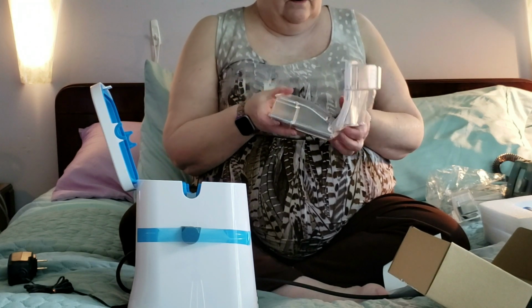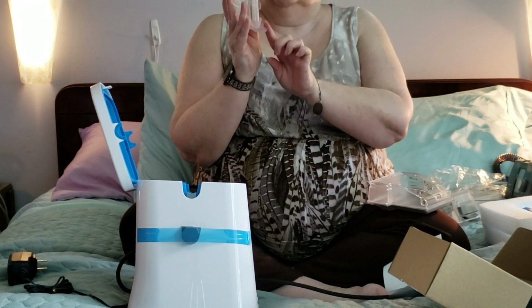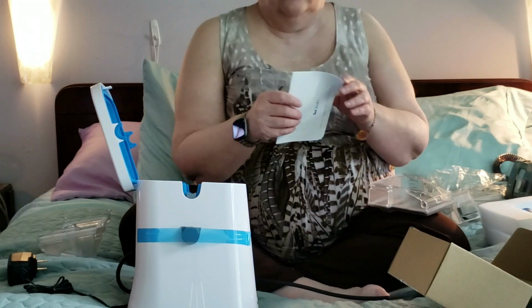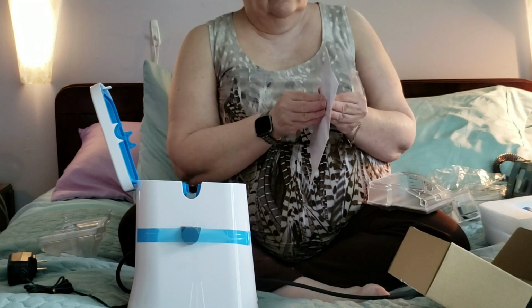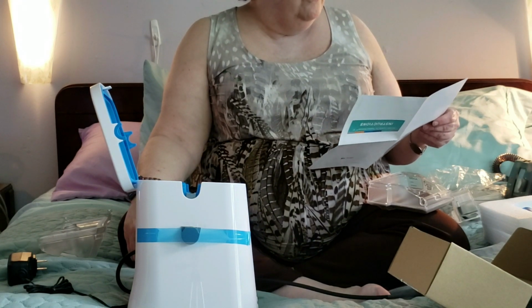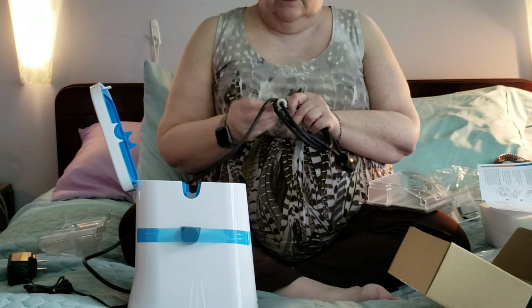And now I have to figure out. Oh, and then I just had a couple of side pieces to push and a back piece. I don't know if you could see that. It wasn't very exciting. So the instructions say, connecting the adapter. Detach the injection fitting and short hose from the main SoClean hose. So let's get this. Oh, I get it, I think.